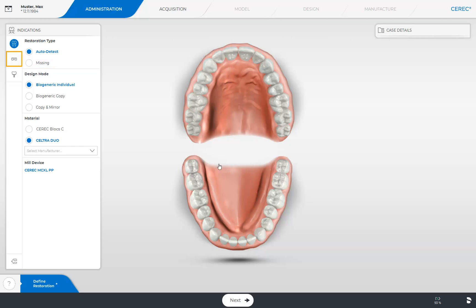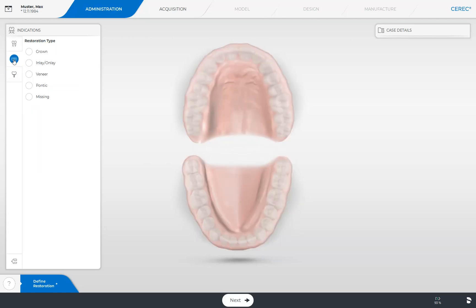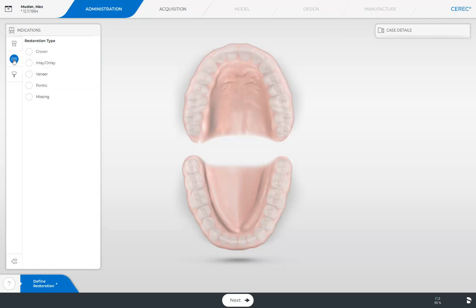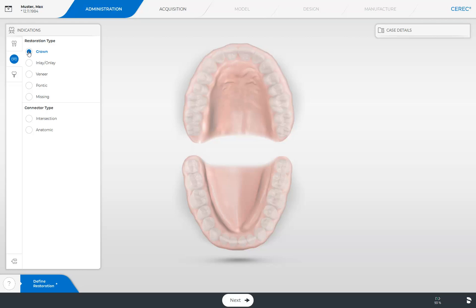Next, we proceed with the creation of the restoration type Bridge. We will determine which type of bridge abutment we are dealing with. We can choose from among Crown, Inlay, Onlay, and Veneer. In our case, we tap Crown. Next, we select the connector type Anatomic, since this type can be individualized separately.